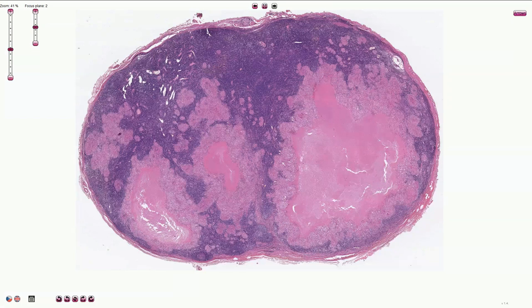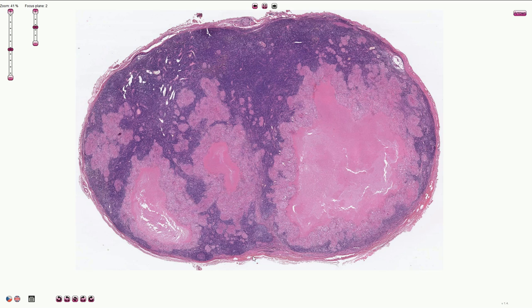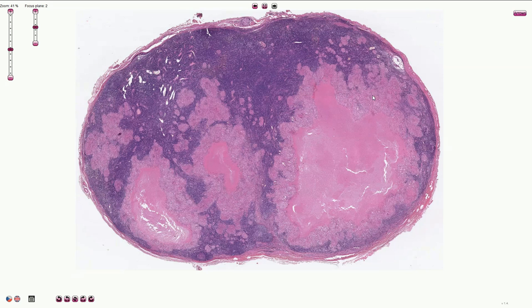Here we see Mycobacterium tuberculosis lymphadenitis, or tuberculosis of the lymph node, which is characterized by multiple granulomas with caseous necrosis. Here we can see the capsule of the lymph node, and here in the periphery we can identify the residual follicles with germinal centers. However, the rest of this lymph node is infiltrated by these granulomas with caseous necrosis inside.